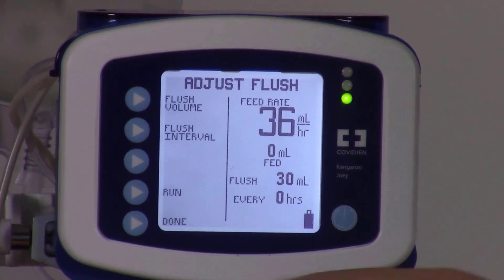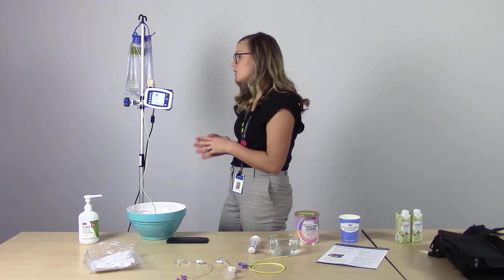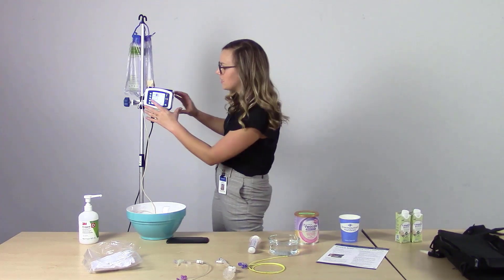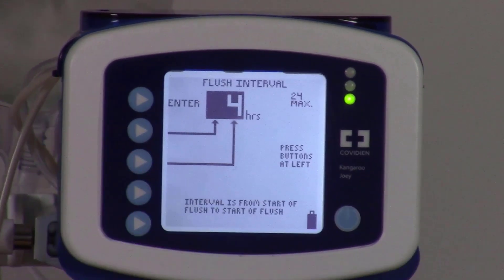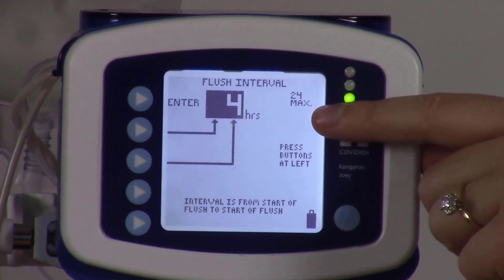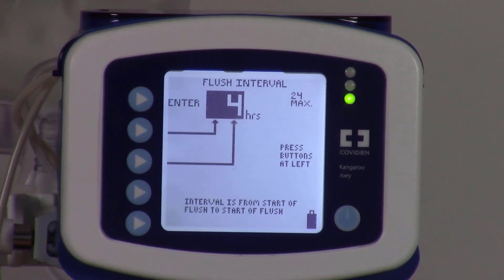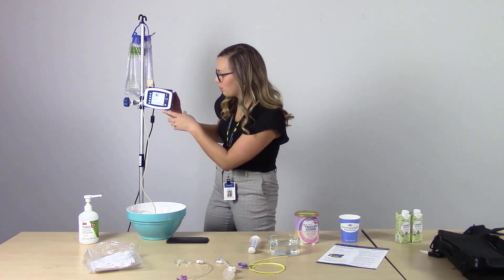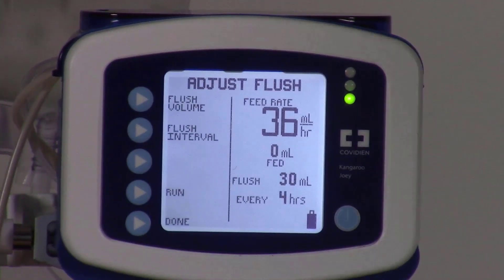The next button is flush interval, which means how frequently the pump will flush. We want it to flush 30 milliliters every four hours, so we're going to set this to four. Note that the max is 24 on this pump and the minimum is one hour — meaning if you set one it will flush every hour, and if you set 24 it would flush one time in a 24-hour period. Since we wanted to enter four, we'll press enter, then press done.